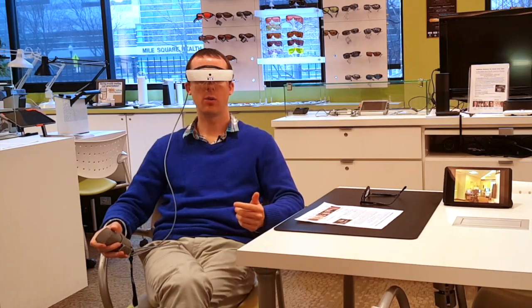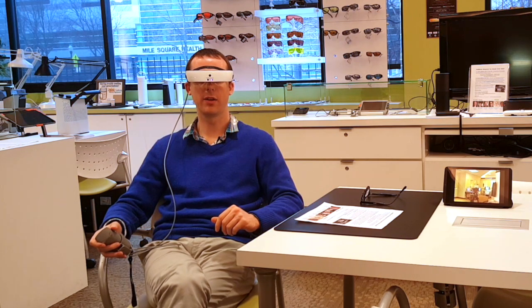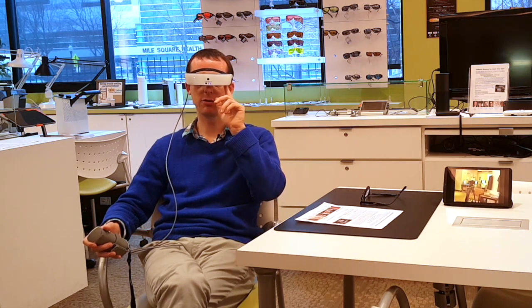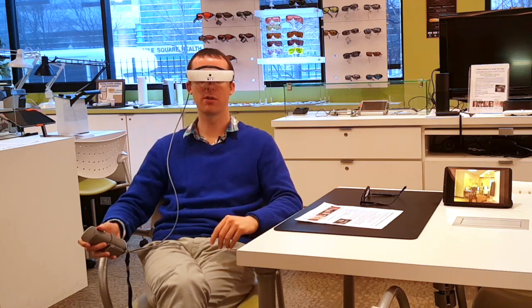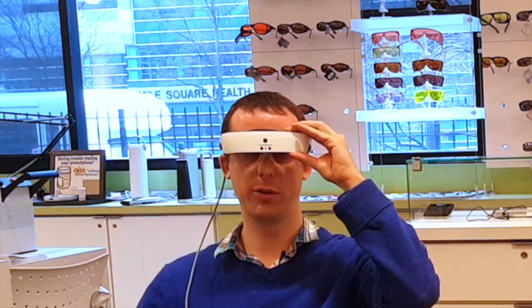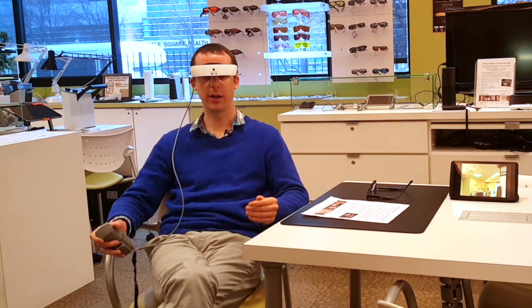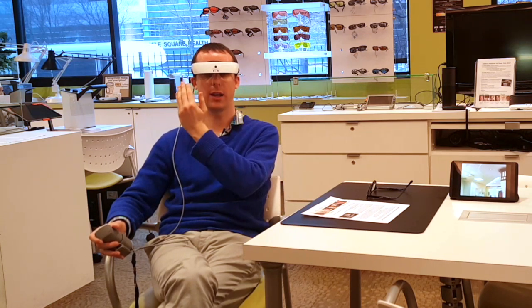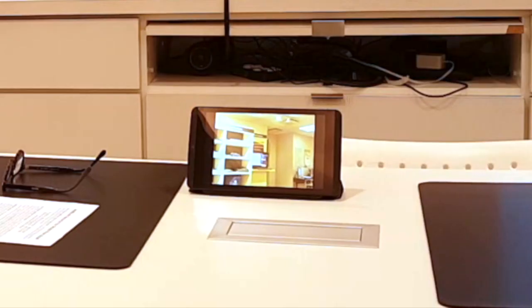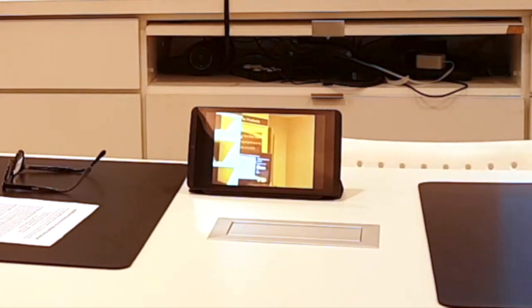One feature unique to eSight among wearable devices is the bioptic tilt — a unique tilt system. The idea is you're able to wear eSight when walking around. At the moment the video screen is completely down, covering my field of vision. It wouldn't really be safe to walk like this. However, we can tilt the headset up into one position where I can see quite a lot underneath the electronic part, giving a good field of view while walking. If I want to look at something, I can still see the video screens by looking upward and point my head towards something to magnify that image.